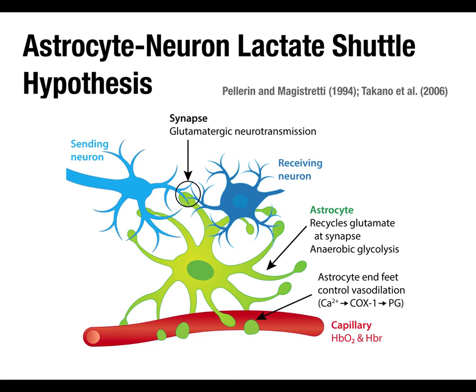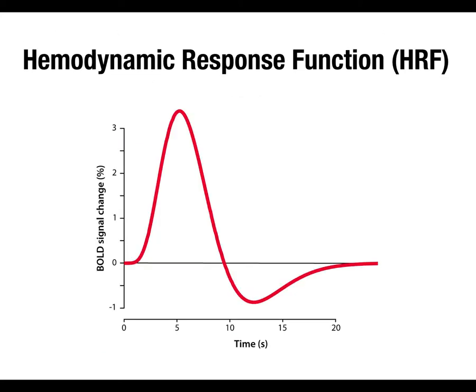Whereas with EEG, because everything's spatially all mushed together, it's almost more of a moot point, because with EEG, we've got these little components that are biomarkers of particular cognitive processes, and we can see changes in the size of those components or presence, absence of those components that we infer a particular process is happening or not. We're a little less concerned about the precise localization and so on. I'm going to come back to that in a little bit.